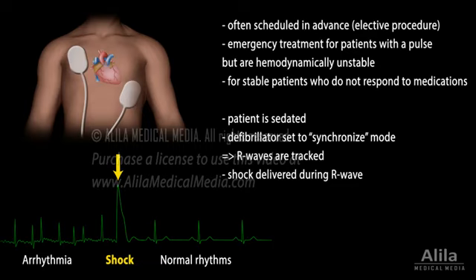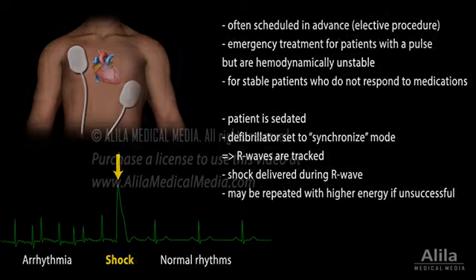The result should be immediate. If the first attempt is unsuccessful, subsequent higher energy shocks may be performed. The procedure itself takes only a few minutes.